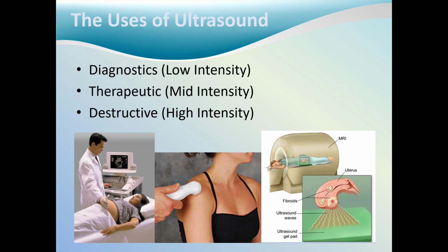Remember that diagnostic ultrasound has a low intensity. Therapeutic ultrasound, which is the focus of this lecture, has a mid-range intensity, and destructive ultrasound has a high intensity. When comparing ultrasound to other superficial heat treatments, the ultrasound treatment is deeper. Warm whirlpools, paraffin baths, and silica gel hot packs all produce therapeutic heat, but their depth of penetration is superficial, at best only 1 to 2 centimeters.